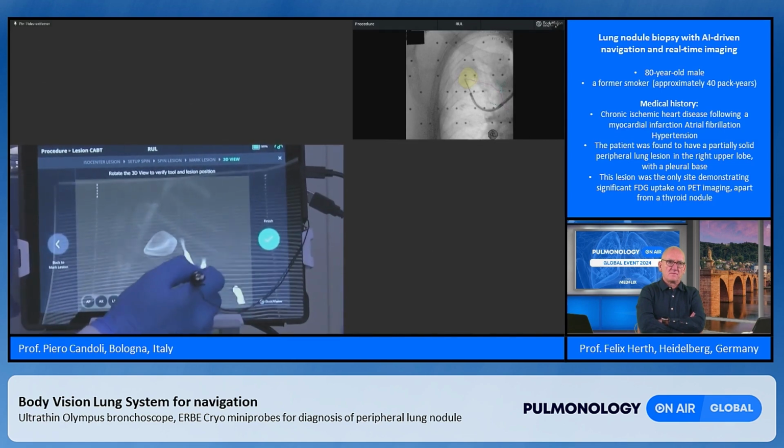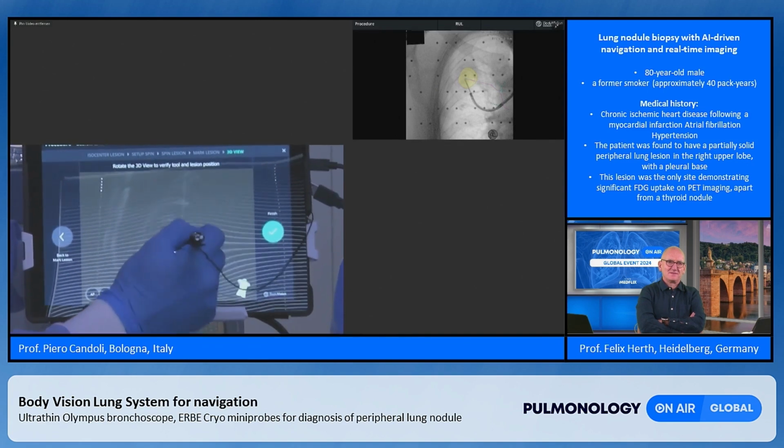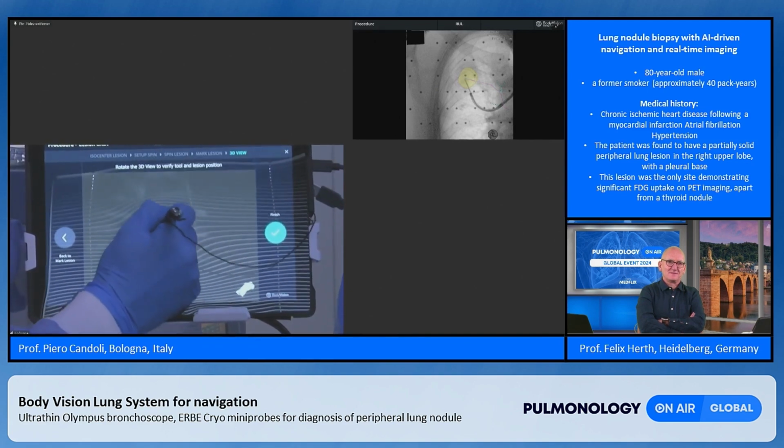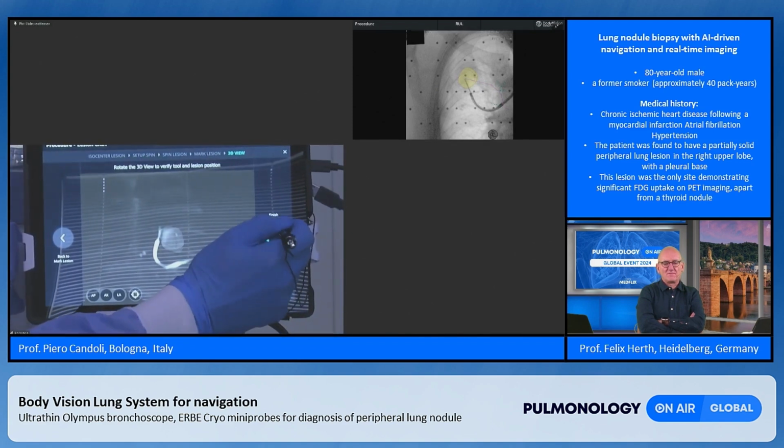Okay, we are closer than before, not in. We are adjacent, but not in.